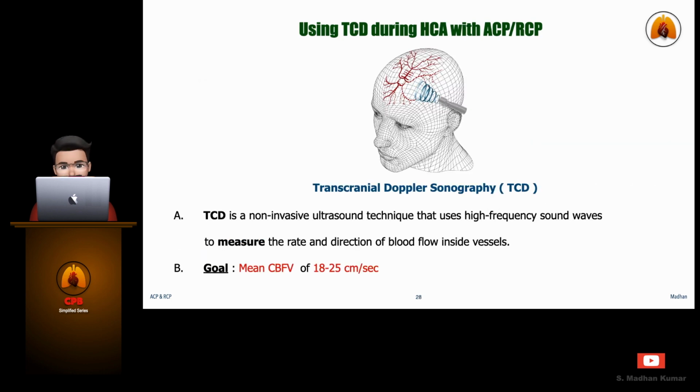Transcranial Doppler is used for real-time cerebral blood flow velocity monitoring in the basal arteries of the brain. During ACP, the left side of the brain may develop significantly lower regional oxygen saturation than the right side. This occurs because all the flow through the left side during ACP must occur via the circle of Willis, and patients having an incomplete circle of Willis will have RSO2 30% lesser than the right side. So, bilateral cannulation is preferred in patients with incomplete circle of Willis.